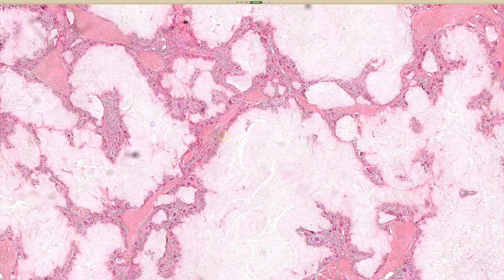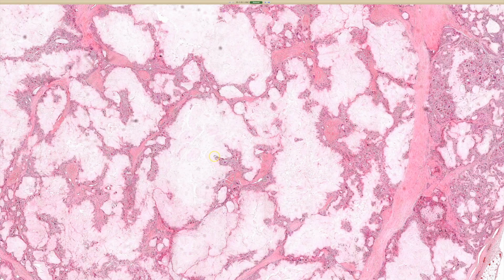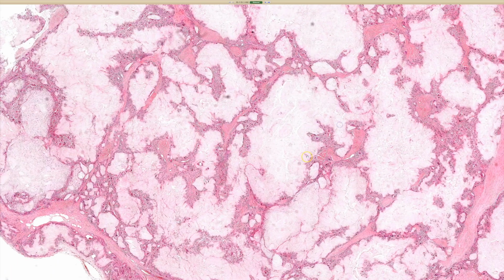The monosodium urate crystals produce a really intense granulomatous reaction, and this is very painful. And if you teach whoever is grossing the specimen, if they cut open a specimen, even if it was received in formalin and it looks chalky and chunky like it might be gout, or if the surgeon submitting it said rule out gout, you can take a glass slide and touch or smear it against the chalky stuff in the tissue, just fresh on the slide, and air dry it, don't do anything else to it.